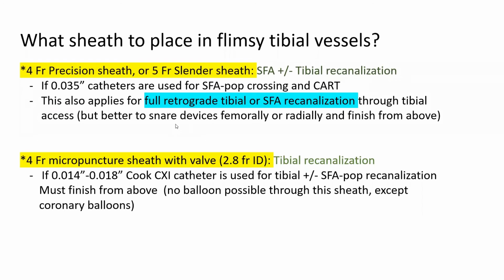So in terms of hemostasis, to give you an idea, the best technique is to use the TR band. That's the technique I've done. I put a TR band and leave it on the sheath, and I inflate enough to achieve hemostasis. A lot of times I achieve hemostasis just by the tie itself, without having to put air in it. But I put barely enough air to achieve hemostasis. I keep it on for about 1 hour. For the posterior tibial, I sometimes keep it up to 1.5 hours. Then I deflate, and I typically deflate fairly quickly. I try to deflate it fully, or at the very least be fully deflated within 15 minutes. So that's how I do it, typically with a TR band.